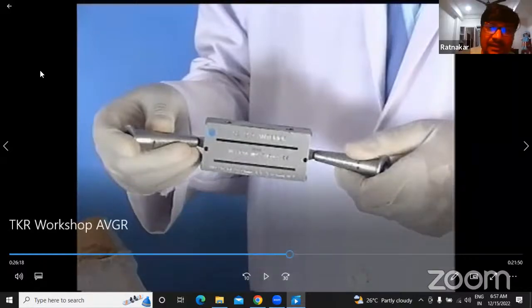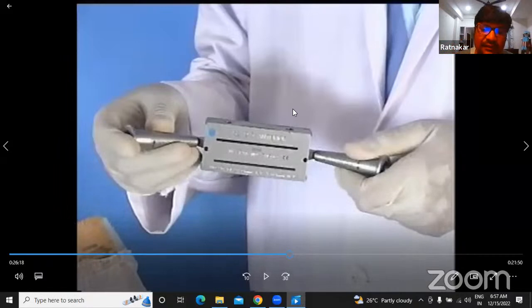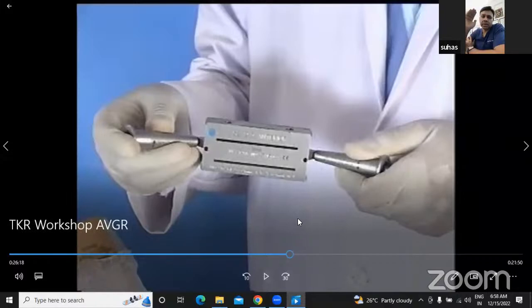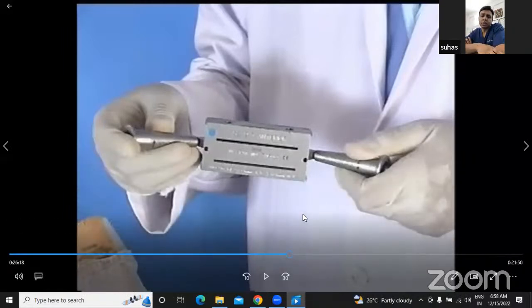A point to be added, sir, here. This particular jig, which is demonstrated here, has a fixed 3 degrees of external rotation. Now the newer version of the PFC Sigma, which is called the high performance instrument, you can dial 1, 2, 3, 4, 5, and you can change your external rotation. Mind you, the PFC instrumentation which we are using now was designed a long time ago. So in the further iterations that have come, the high performance instrumentation, the footprint of the jigs, the blocks, everything has come down, as well as the ability to rotate.